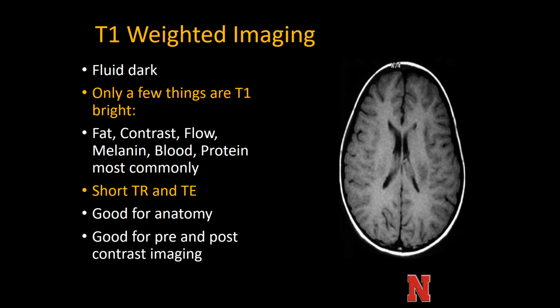So just a couple examples, like I do a lot of body MRI. So most of the liver protocol MRI, pre and post contrast, is done as a T1 weighted fat saturated image, pre and post. So on the post contrast image, if it's bright and it wasn't bright before, that has to be contrast enhancement, which implies vascularity or a tumor or a hemangioma or something like that.